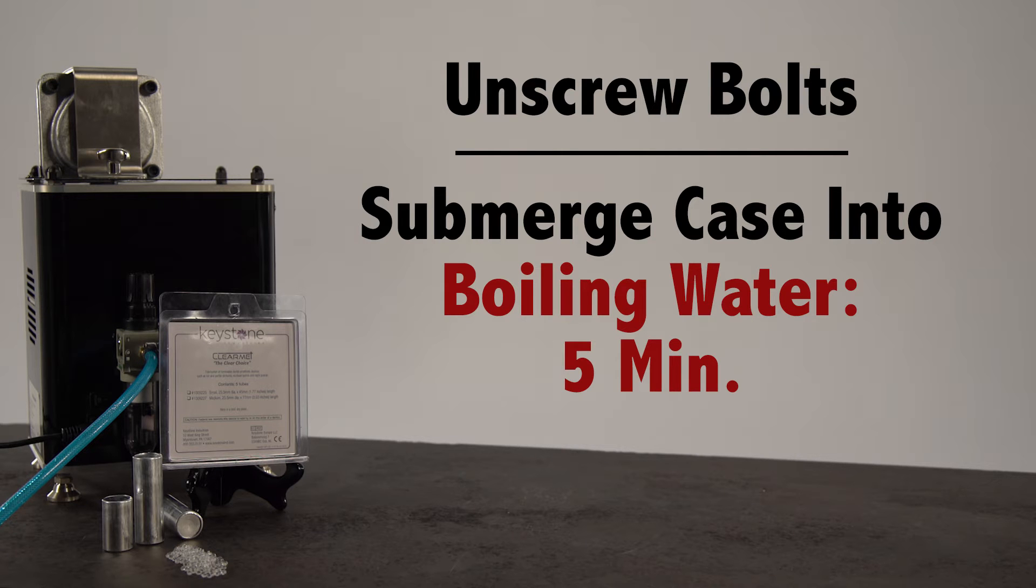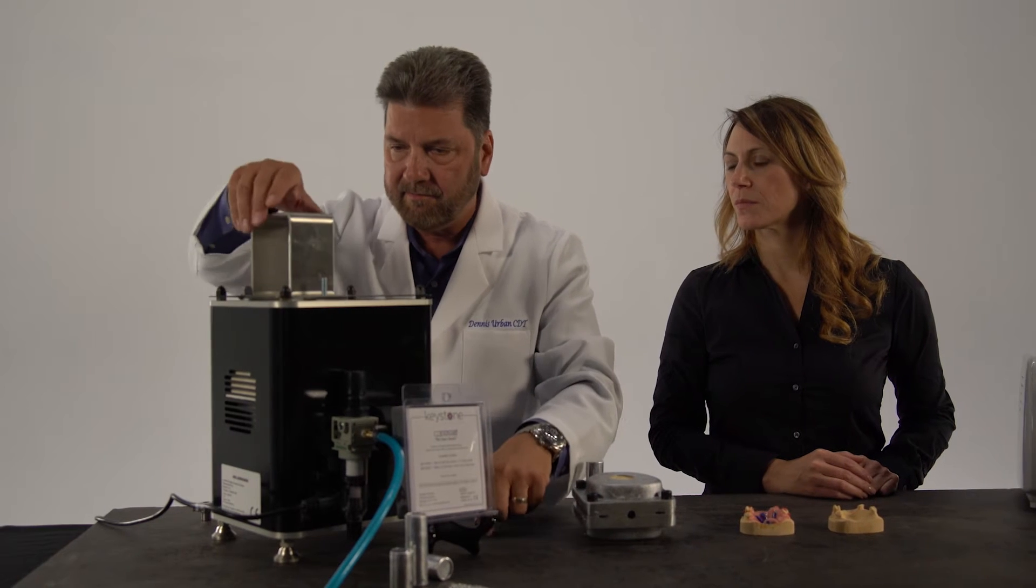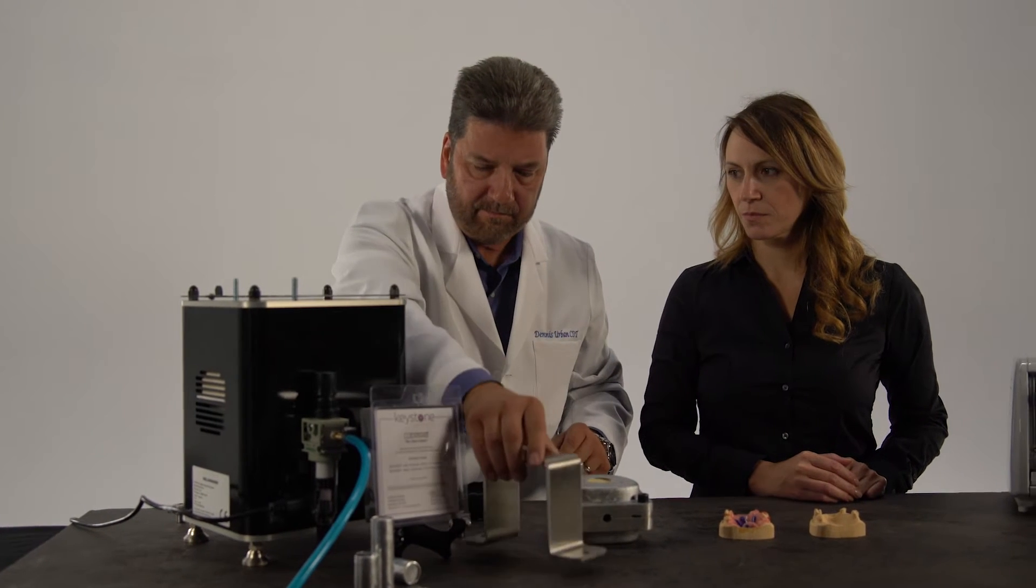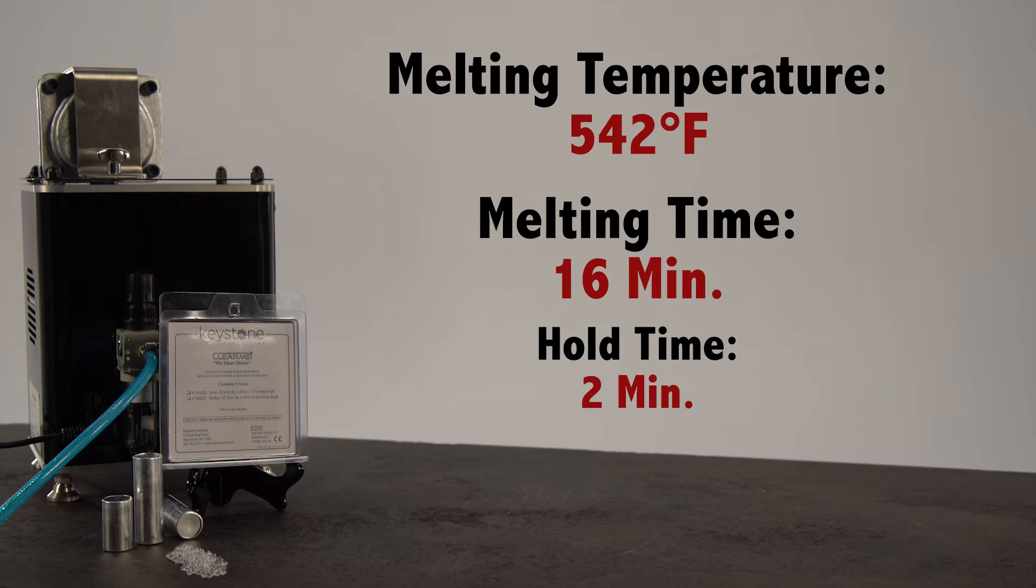Unscrew the bolts and immerse into boiling water for five minutes. At this point, you may turn on the FlexPress digital injection system. Program the injection system with a recommended melting temperature of 542 degrees Fahrenheit. Melt time is 16 minutes with a hold time of 2 minutes.